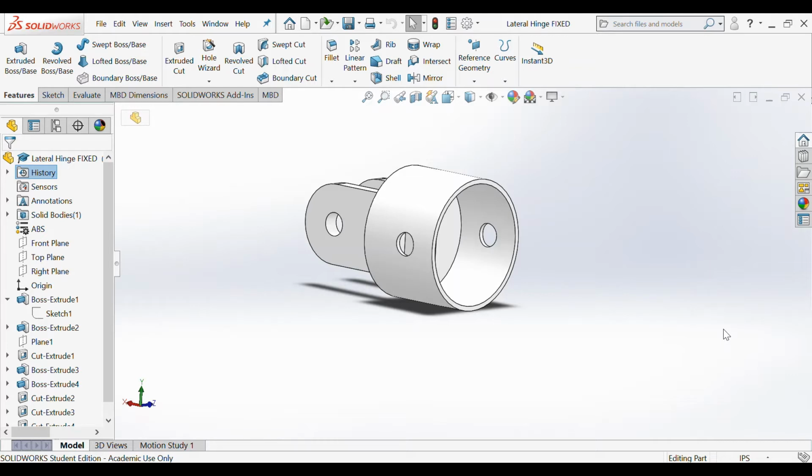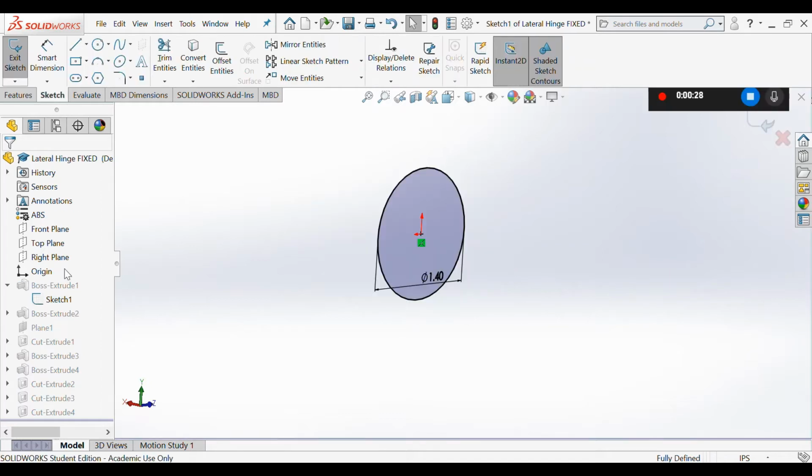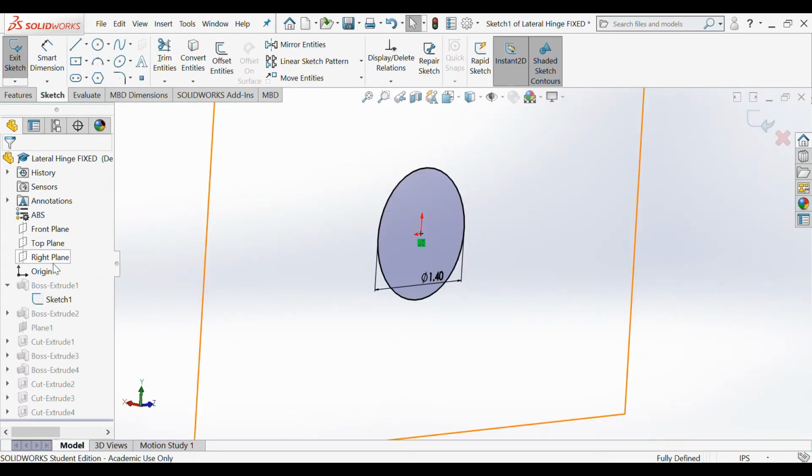Going to show you how to make Epione Biotech's lateral hinge piece for our laparoscopic surgical suturing device. So go on ahead and open up SolidWorks and then make sure that your units are in IPS. So first things first, we're going to go on ahead and make our first sketch. This sketch is going to be on our right plane.